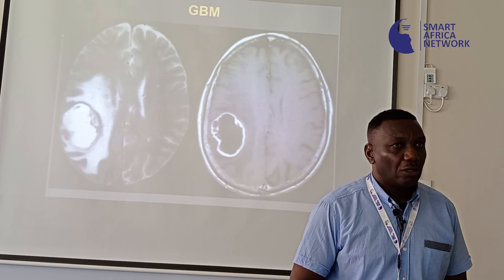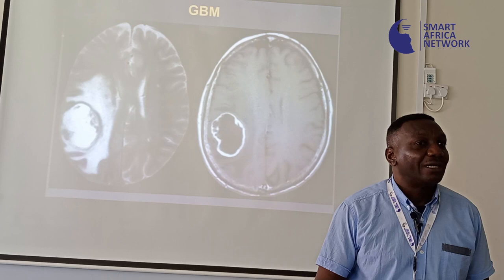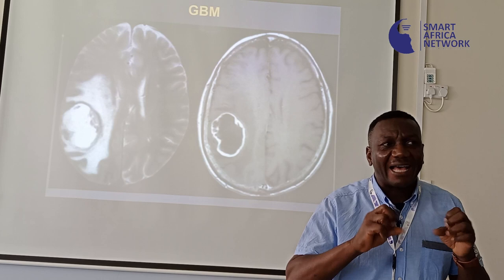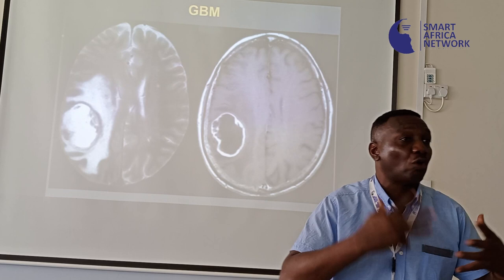We use a contrast material, and give an intravenous contrast, which in the MRI is what's called gadolinium. Gadolinium has a way of interacting with the MRI signals, shortening the signal and producing areas where the gadolinium concentrates in terms of blood perfusion, or disruption of the blood-brain barrier, where there's more concentration, the signals will appear brighter.